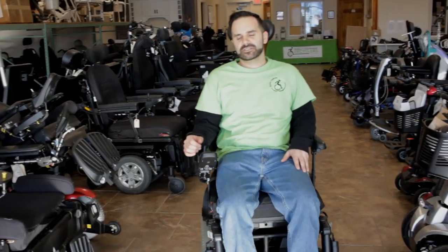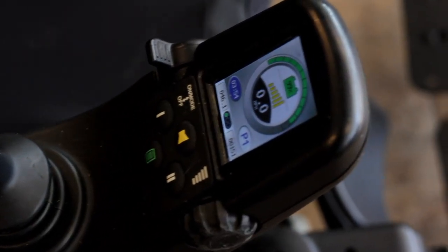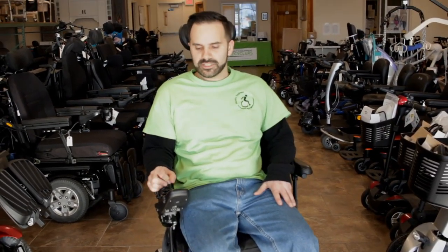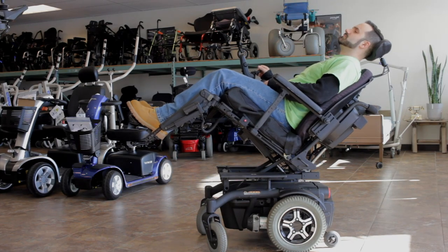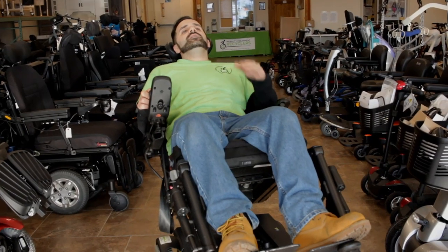To operate the seating functions, we go into the joystick here, into the function screen, and I just use my toggle to scroll through to get which one I want. I'm going to start with tilt — this can bring me all the way back. For users that are in the chair for multiple hours per day, the ability to tilt yourself backwards not only relieves pressure, but it can help circulate blood flow.